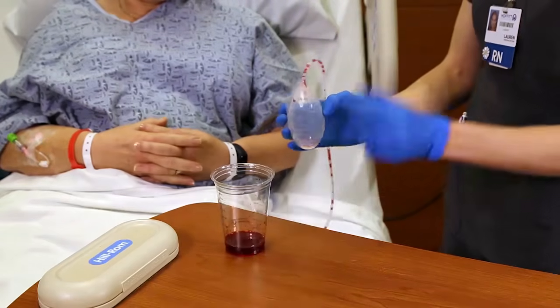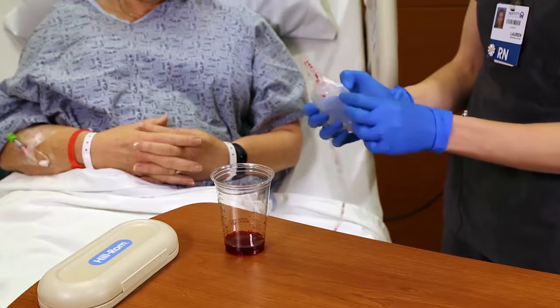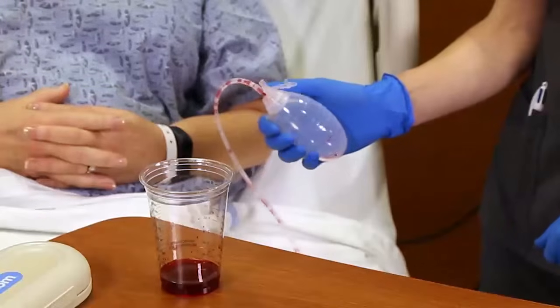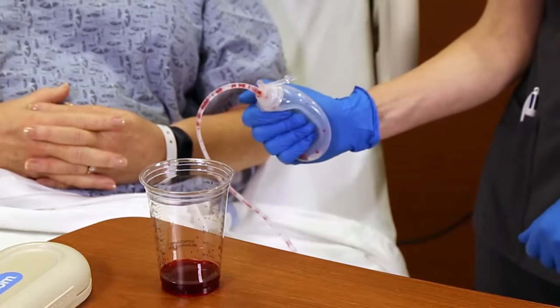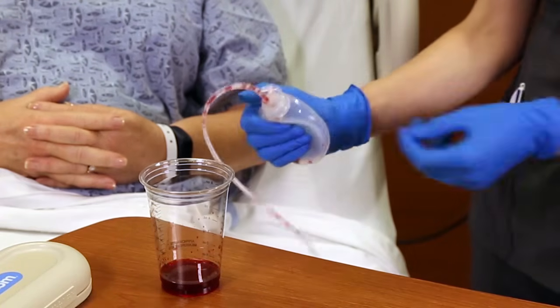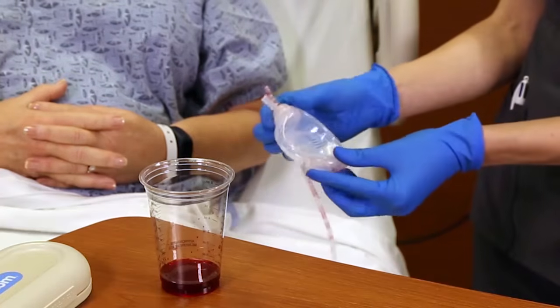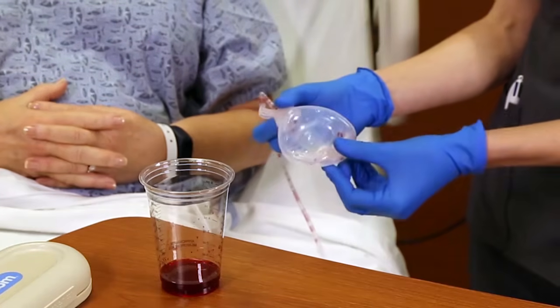Be careful not to touch where the plug inserts into the bulb or the plug tip itself. After emptying the fluid, squeeze the middle of the bulb and replace the plug while still squeezing. Keep the bulb away from your face while compressing. The bulb should always be compressed like this to work properly.